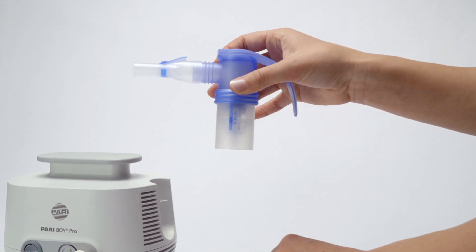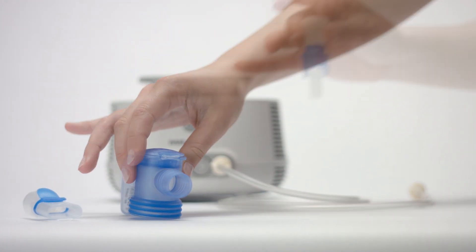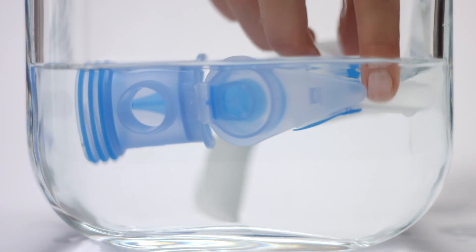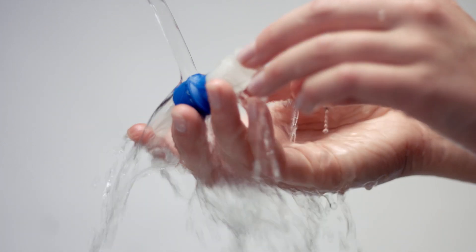Disassemble the nebulizer for cleaning and disinfection. Clean the nebulizer after each use. Wash all parts in warm tap water with dishwashing liquid, before rinsing thoroughly in running water.